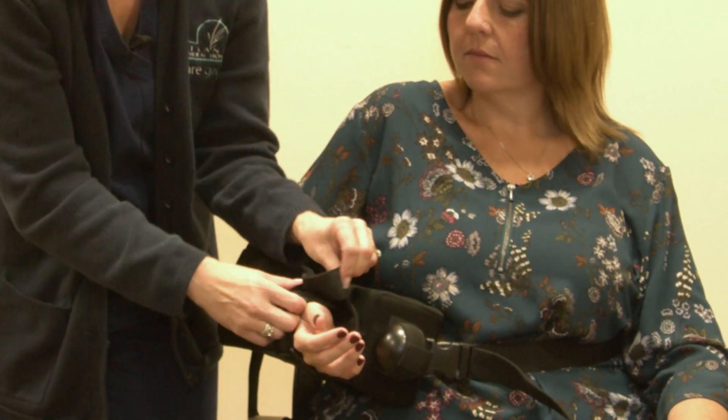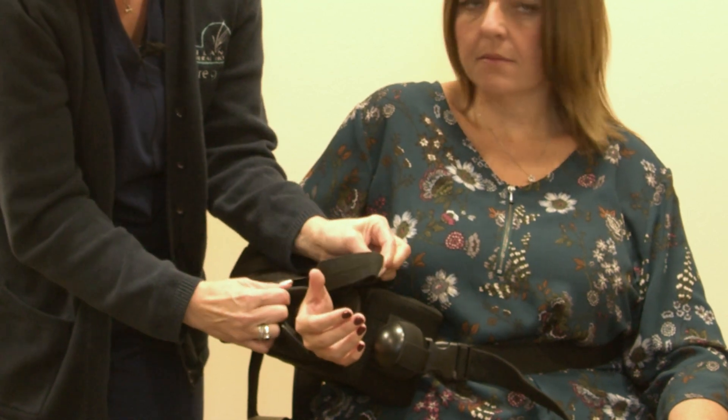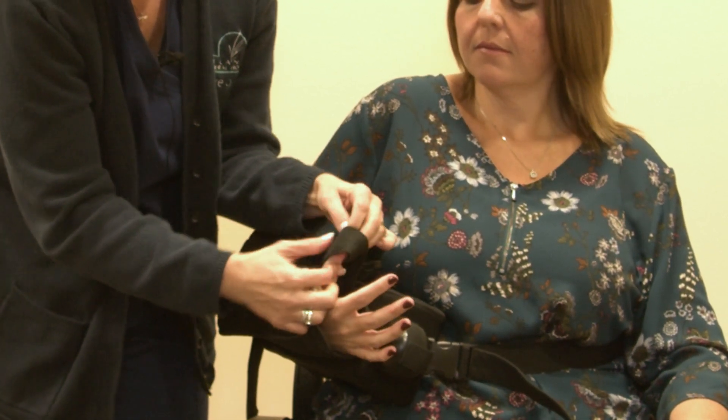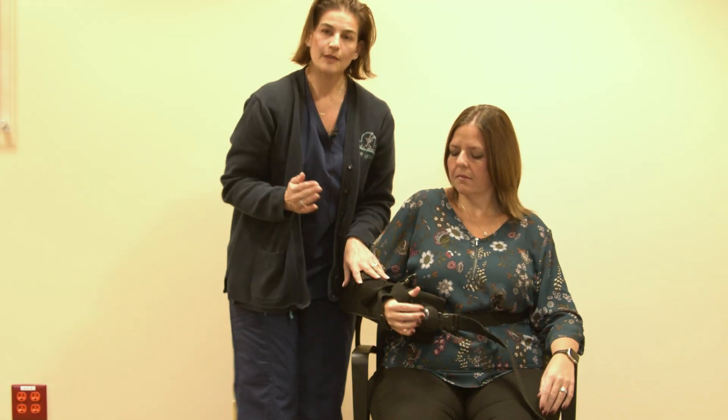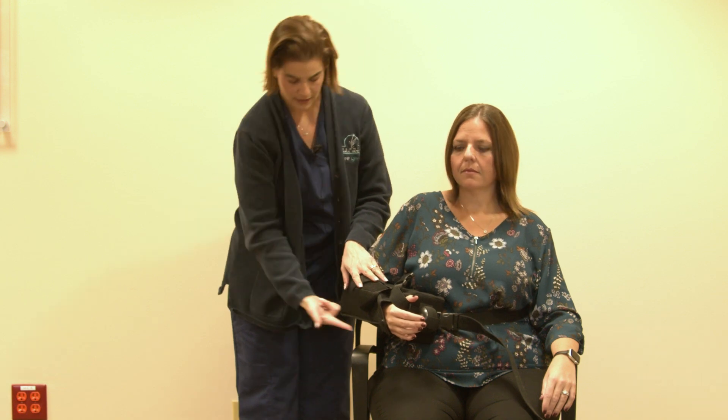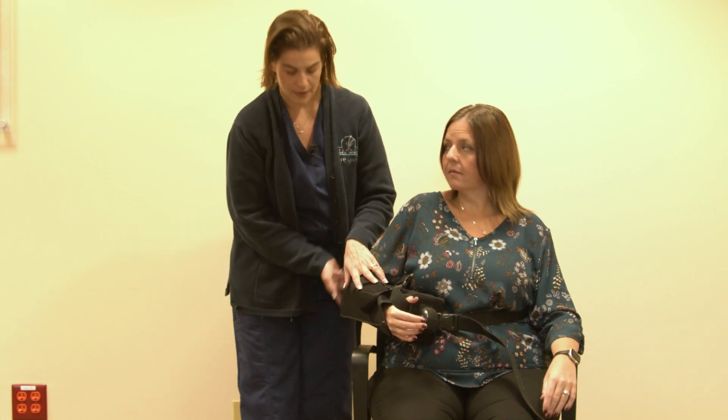There's a small loop in the front. This loop is where her thumb will stay anchored inside. This keeps your arm from sliding forward out of the sling and keeps your elbow back in this nice L-shaped seam.